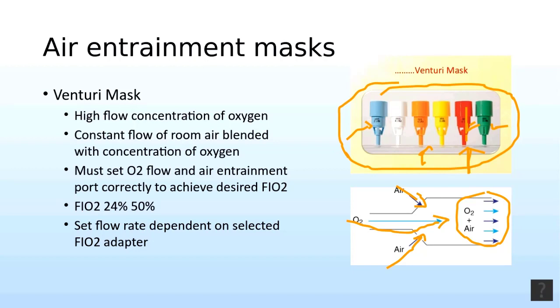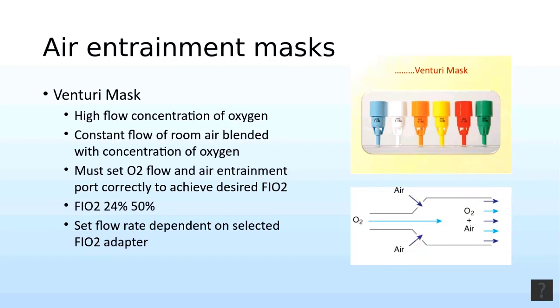FiO2 delivery settings are typically set at 24, 28, 31, 35, and 40% oxygen. The markings on the device indicate how much flow you need to set on the oxygen meter in order to achieve the desired FiO2.